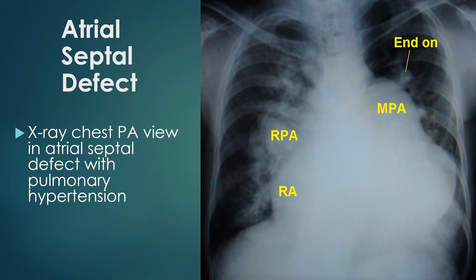Chest X-ray PA view in atrial septal defect with pulmonary hypertension. The main pulmonary artery is grossly dilated. Right pulmonary artery is also quite enlarged. Right atrial enlargement is seen as a shift of the right heart border to the right of the spine. Pulmonary vascularity is increased and prominent endon vessels are seen.